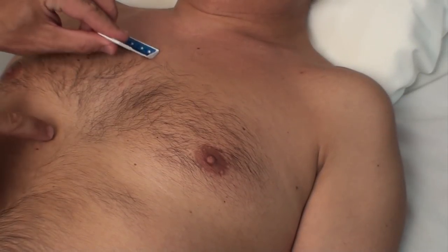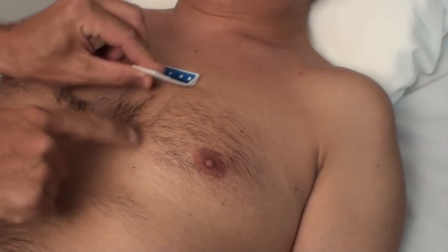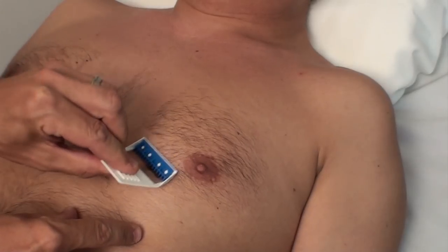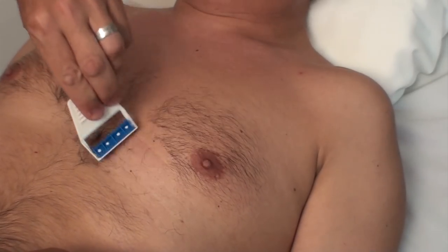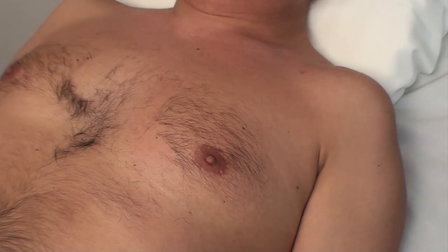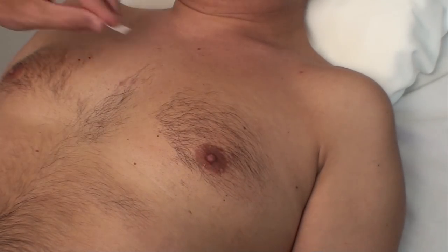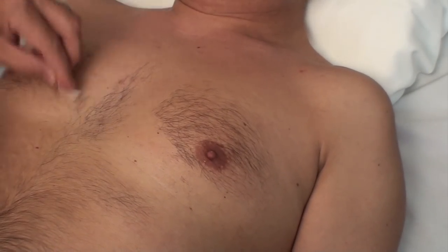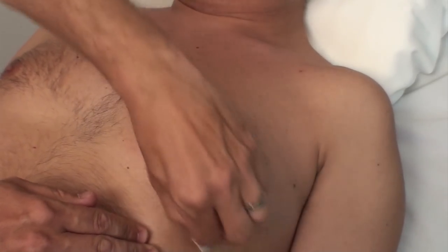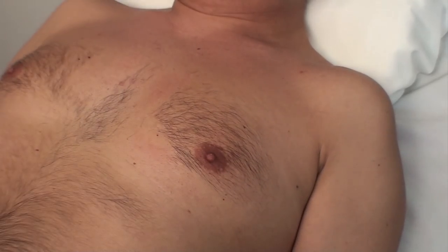Skin preparation is essential for electrode adhesion and conduction. Good skin preparation is the secret of a successful recording. First, if there is any hair on the electrode skin areas, shave it to provide better electrode contact and help reduce painful removal of the electrodes. Clean the skin area with either alcohol or soap and water to remove skin oils. Please note that if the patient has sensitive skin, it is usually better to use soap and water to minimise skin irritation. After cleaning, let the skin dry thoroughly.